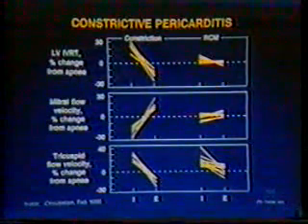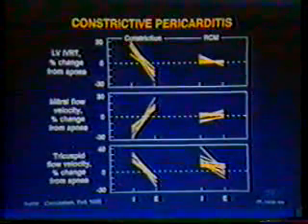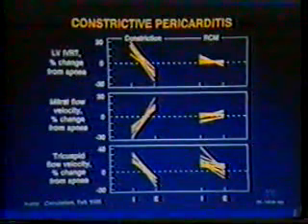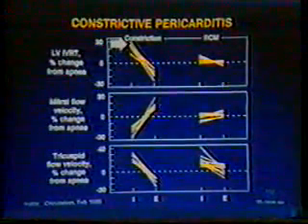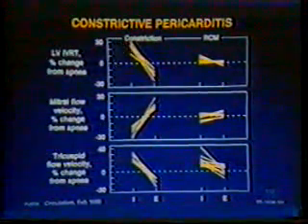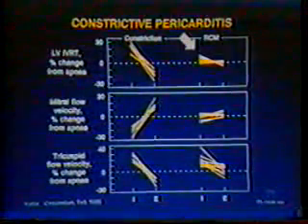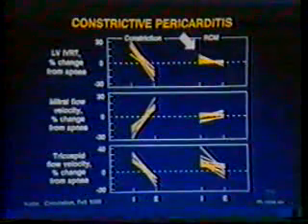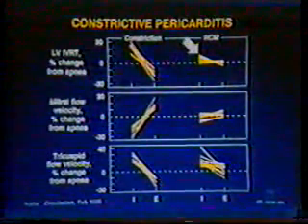Because of the decrease in diastolic filling gradient, the mitral valve opens later with inspiration for patients with constrictive pericarditis. This results in an increase in IVRT with inspiration. Patients with restrictive cardiomyopathy usually have a foreshortened IVRT compared to normals, and there is relatively little change in IVRT during inspiration.